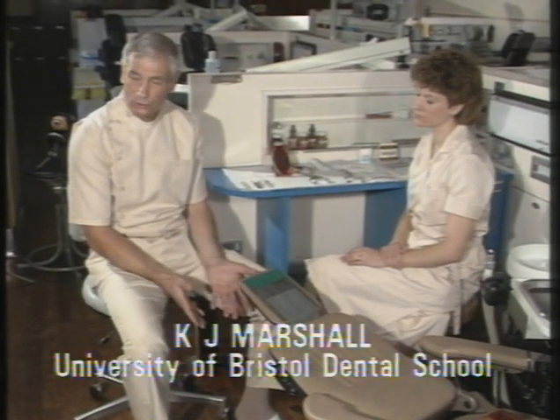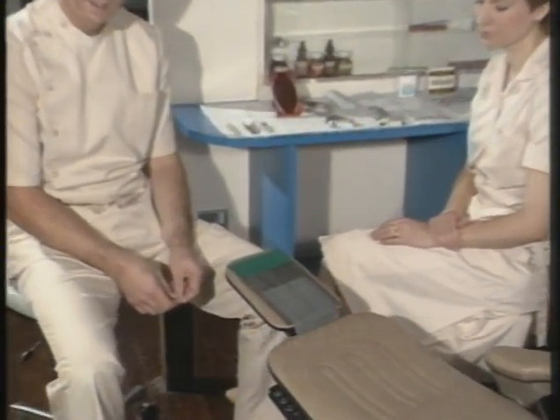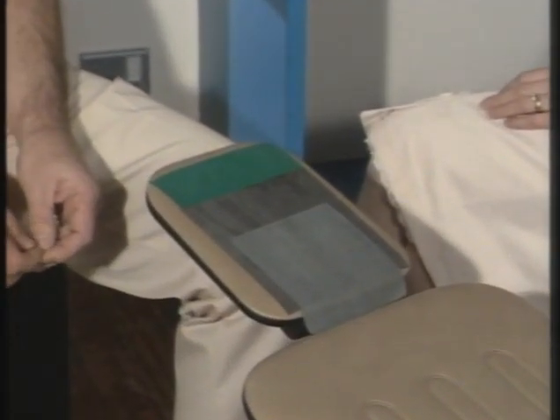Before you begin to use rubber dam, it's obviously essential to ensure that you've got the correct equipment. So let's look at some of the things that you'll need. Perhaps one of the most important things is the rubber dam itself. It's obviously best to have this in a heavy gauge because then it's less likely to tear. It usually comes in a variety of colours, but the two most commonly used are a green rubber dam and the dark grey rubber dam, because these give a very good contrast against which you can work.